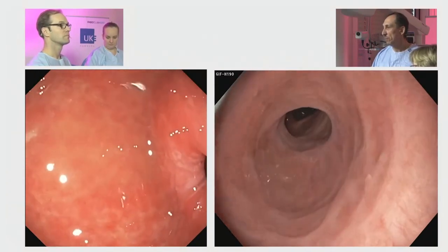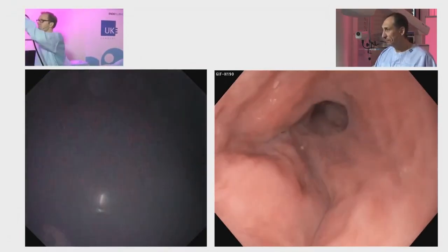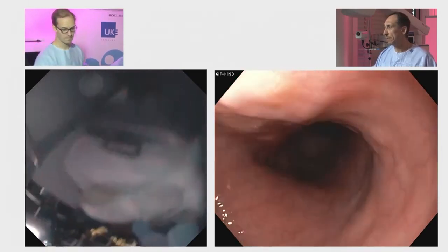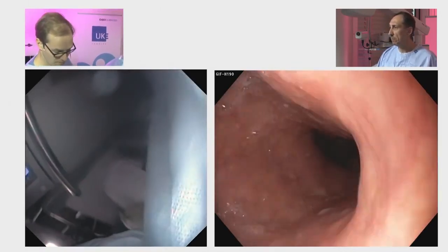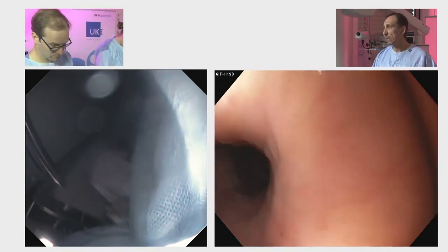You can see these scarring traits from their ESD, from their circumferential ESD. But what we're doing here is performing it with Savary bougies, and what we want to do is the bouginage with these bougie caps that we attach to the endoscope.